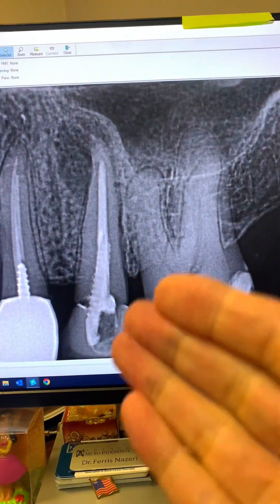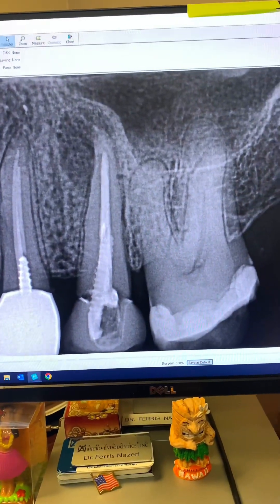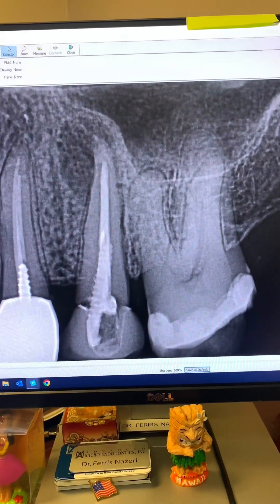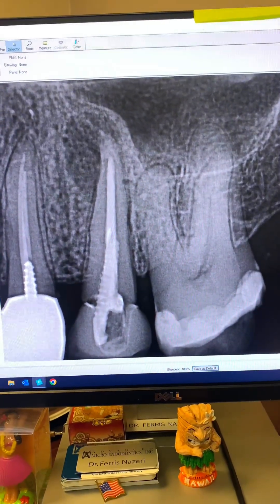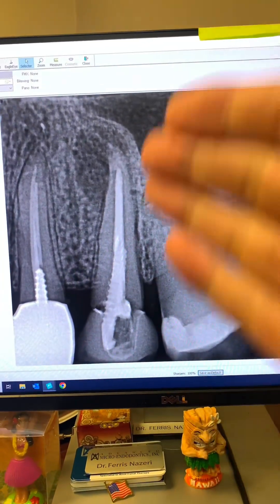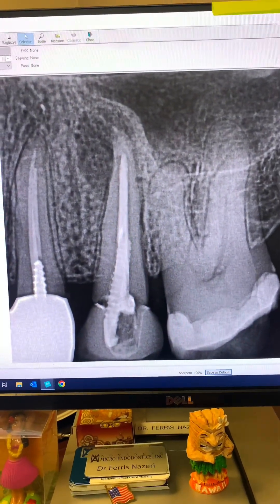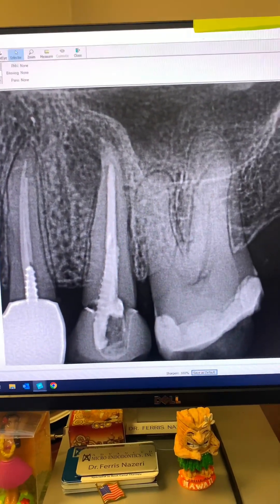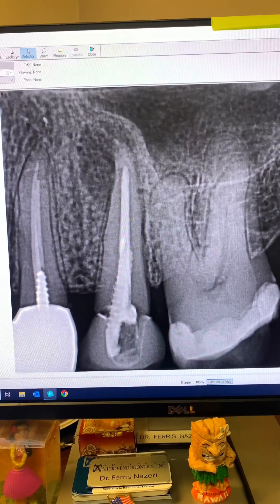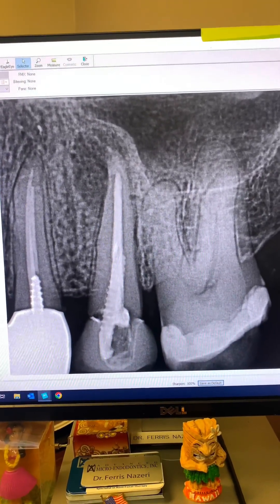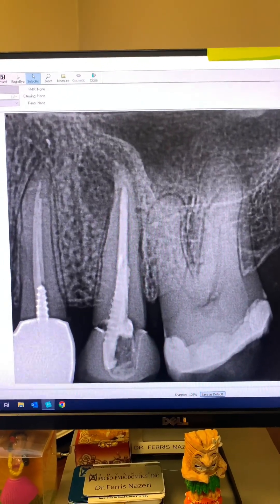So as you saw, based on the location of the sinus tract and also based on the probing, this tooth is not salvageable, and I recommend extraction. The patient will contact her dentist to have the tooth extracted. It's very important to probe every single tooth.